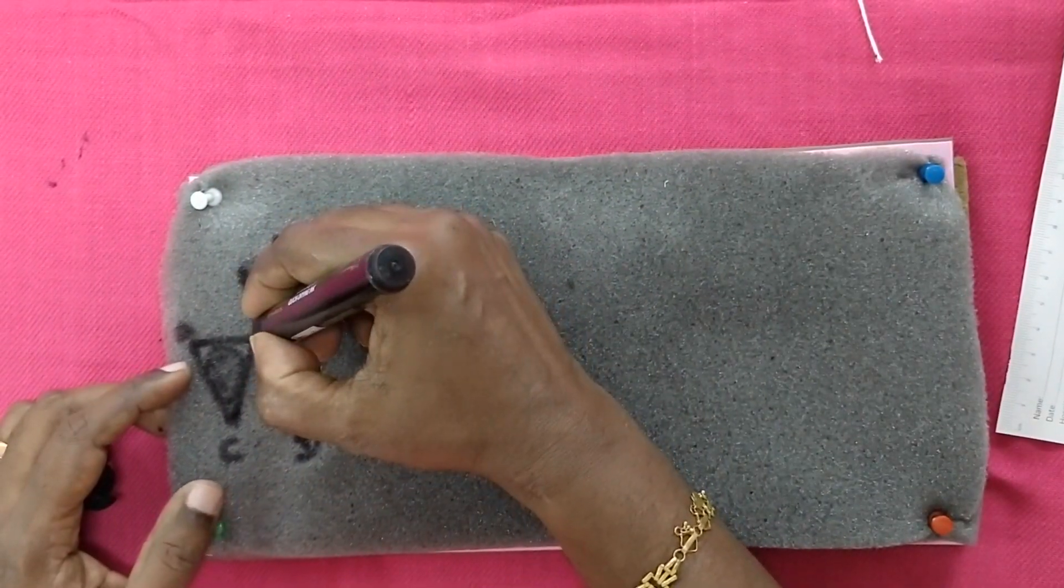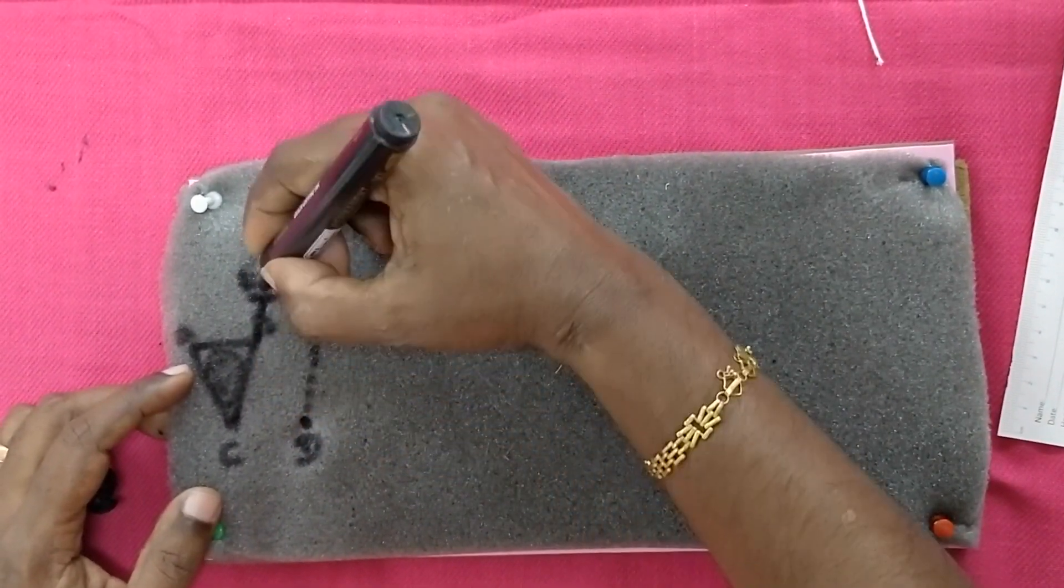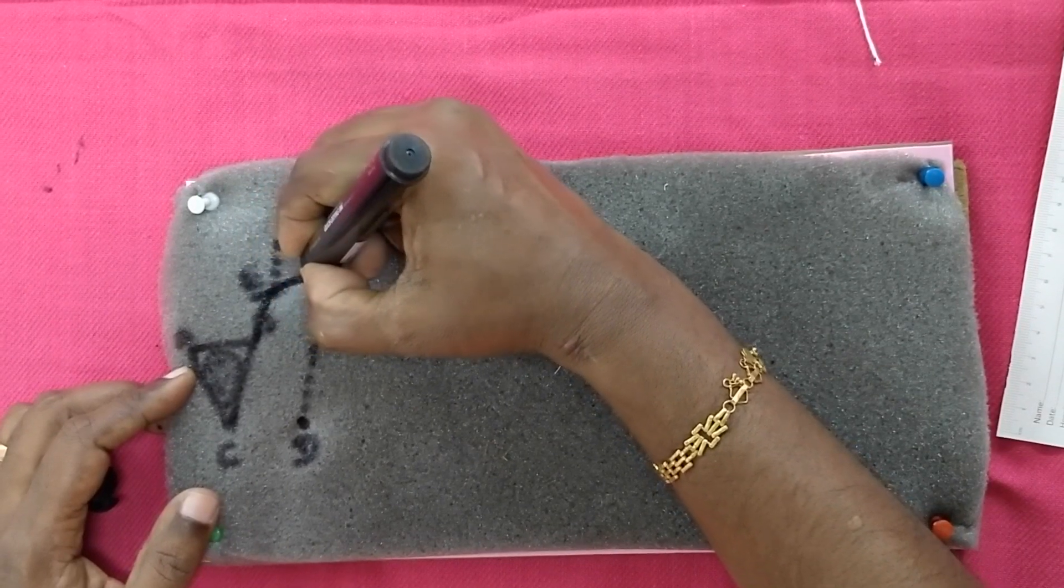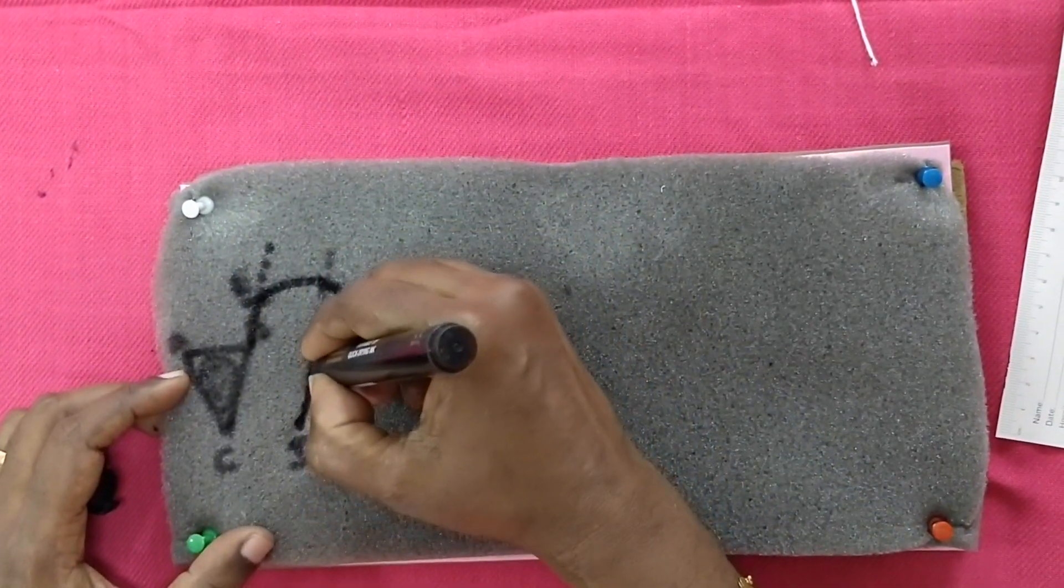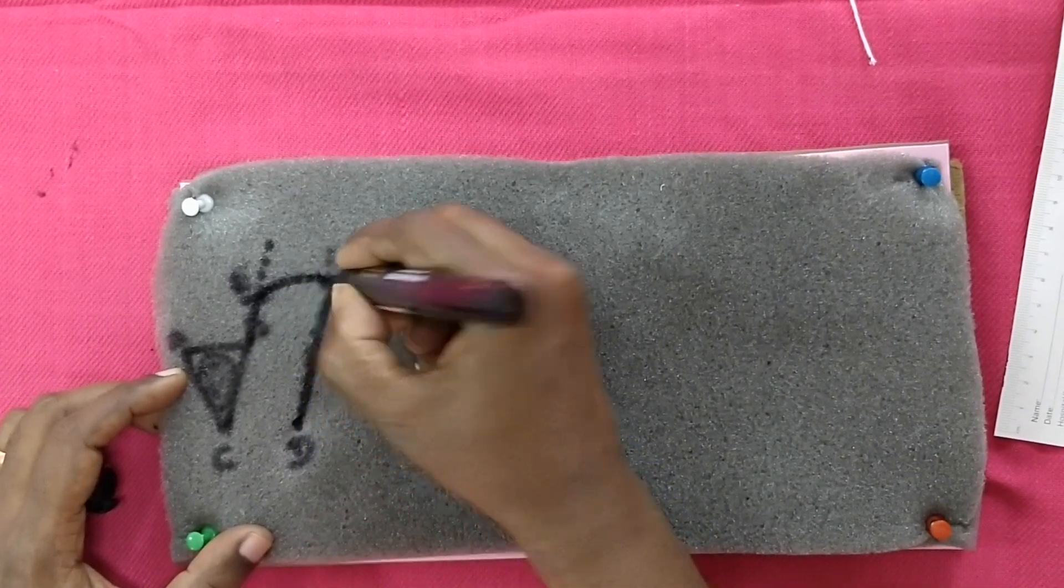It will mark the point F. Now this marking from B to E and E to F and D to F are done.